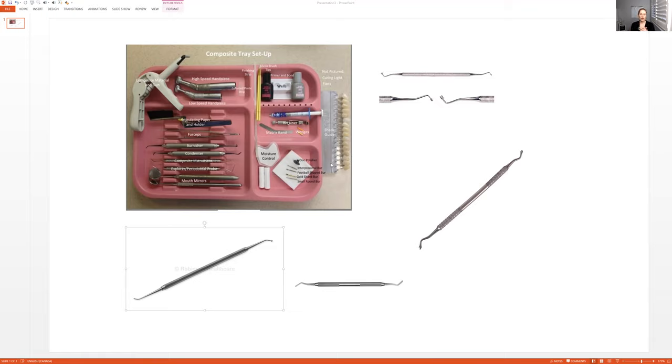So for a composite tray setup, this is when you see on the chart that the patient has a cavity that needs to be fixed. If your dental office does amalgams, then you might be doing an amalgam instead of a composite. So hopefully it will be specific on the tray what you'll be doing — composite or amalgam. In the offices where I work now, we don't even use amalgam. It's just something that nobody seems to want, so it would always be composite anyway.